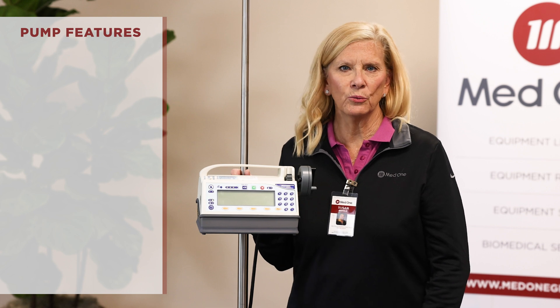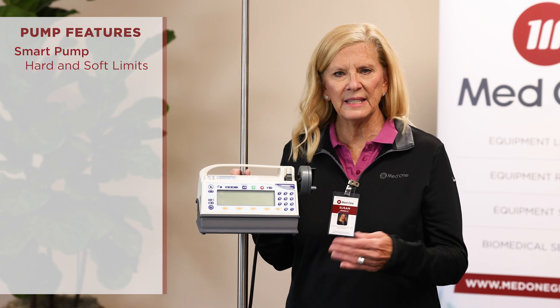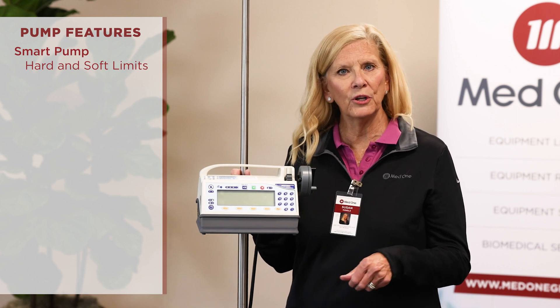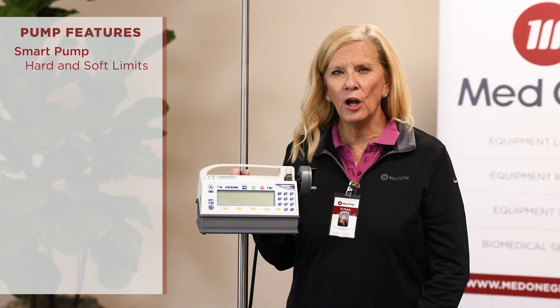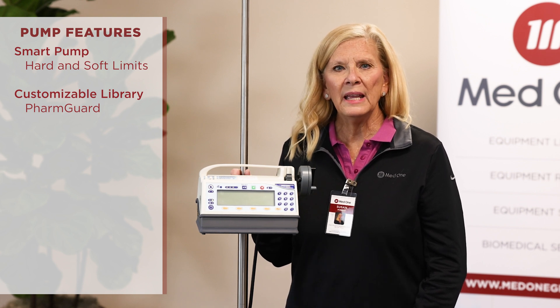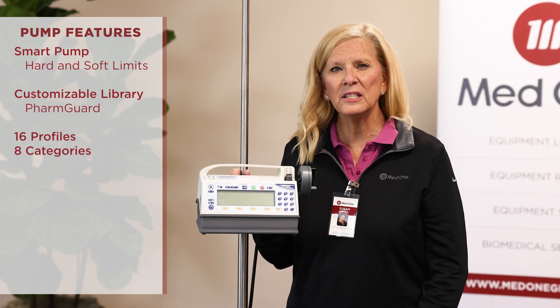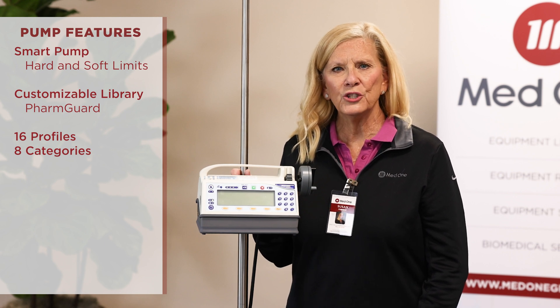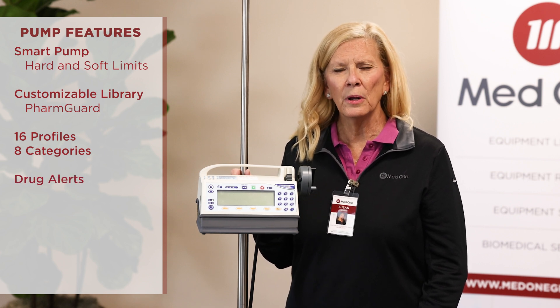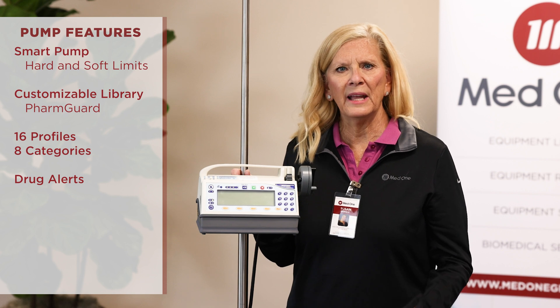The MedFusion 4000 is a smart syringe pump with hard and soft limits, so if you make a mistake you can say no, or if you need to override you can say yes. It also has hard limits where you can't give that dose and have to go back and reprogram. It has a customizable library called PharmGuard software that you can customize and build to your hospital's formulary. It has 16 profiles — such as pediatrics and ICU — and eight categories, which are basically speed keys or shortcut keys that get you to sections of the alphabet much quicker to save time in programming. It also has drug alerts, which are like a post-it note to the nurse for a specific protocol, such as two-RN checks or use a filter.